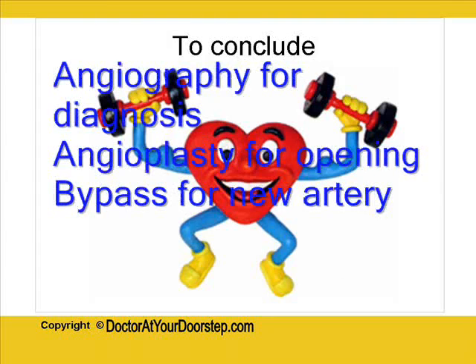To conclude this session, we have seen that angiography is meant for diagnosis of the blockage, whereas angioplasty and bypass operations are meant to provide blood to those areas which were not receiving blood. Angioplasty is only the opening up of the blockage, while bypass is bypassing the blockage. We do not touch the blockage but provide a new pathway for the blood to reach those areas which were not receiving blood earlier.